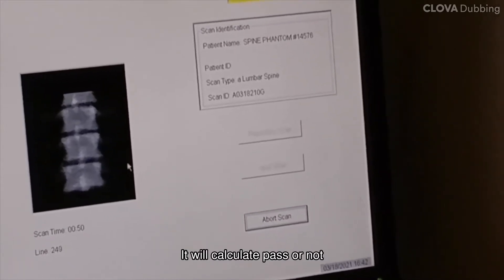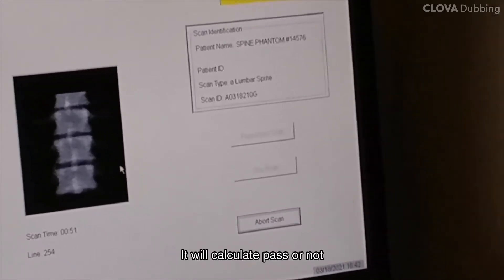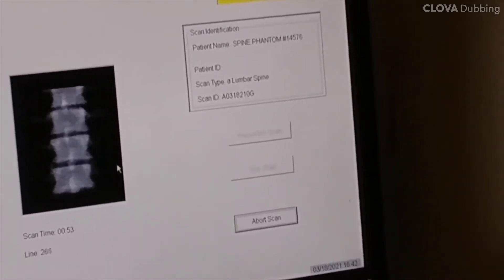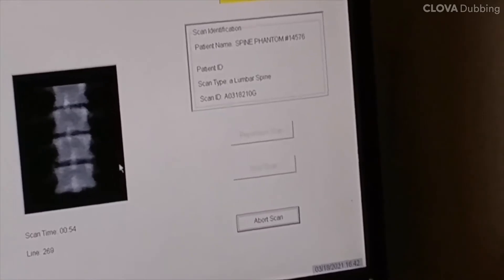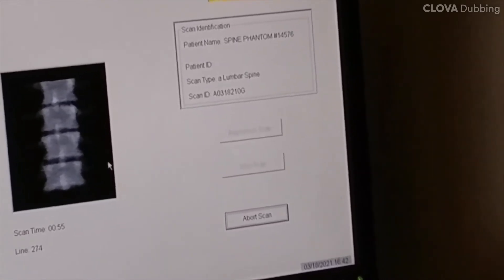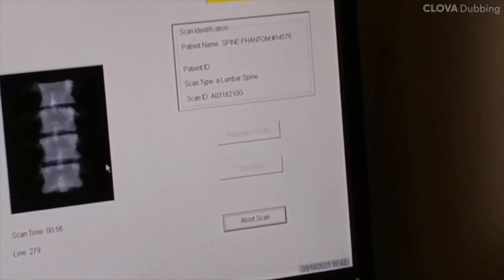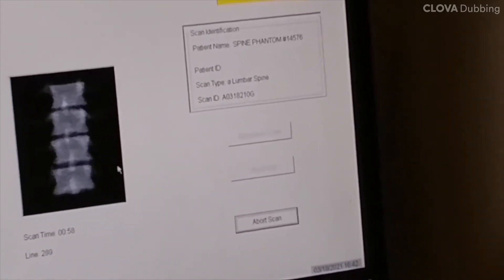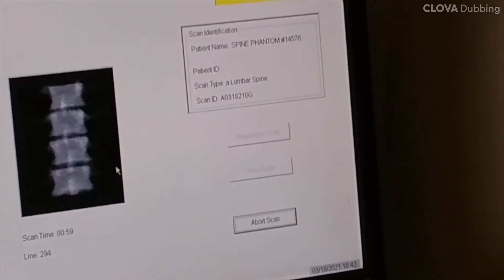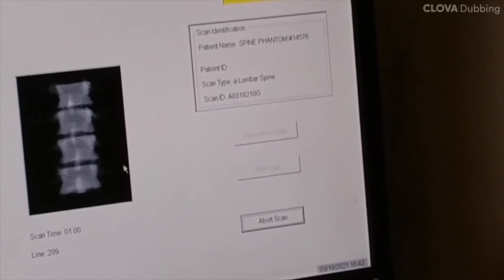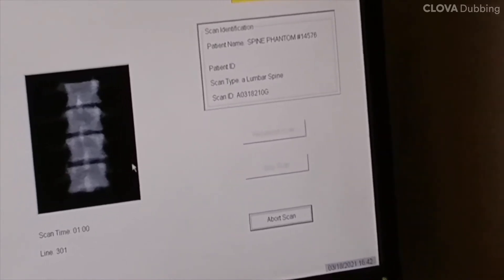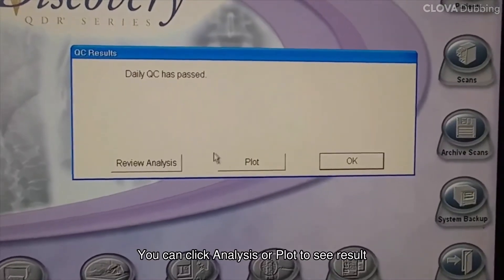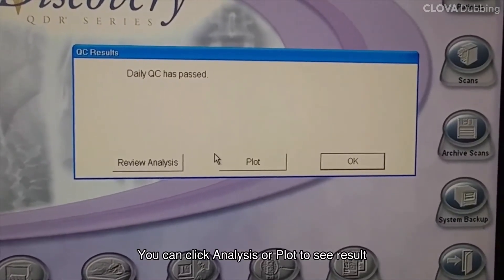It will calculate pass or not. You can click analysis or plot to see the result.